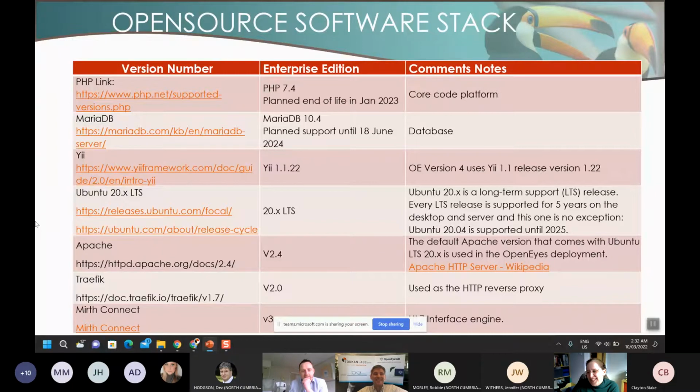Thanks, Des. Steve Dobie, I know you've got a question. I think it's all about a slide. So you're using Mirth with the MariaDB.